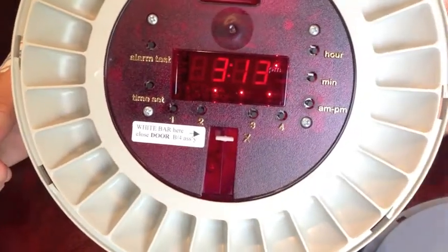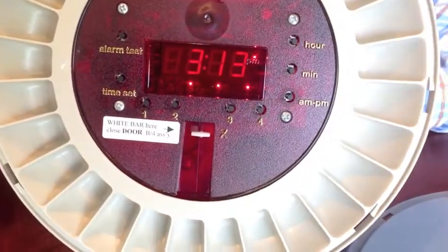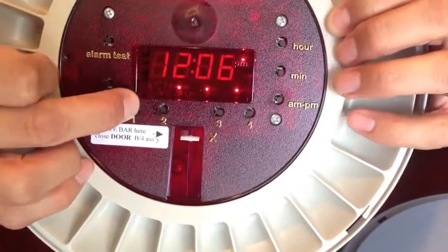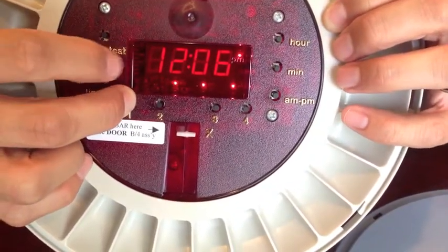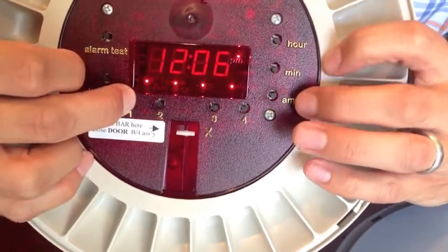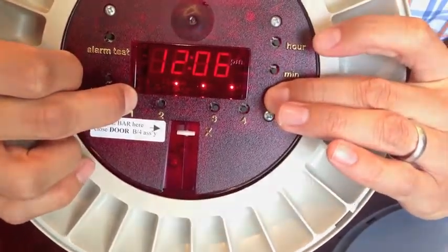If you look at the top right-hand corner of the clock here, you'll see that the PM light is on. If you need your alarm times in the afternoon, you're going to want to make sure that the AM and PM light is on. To change that, just simply press this AM and PM button.